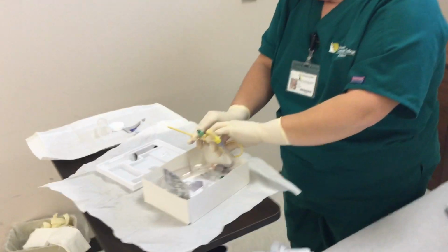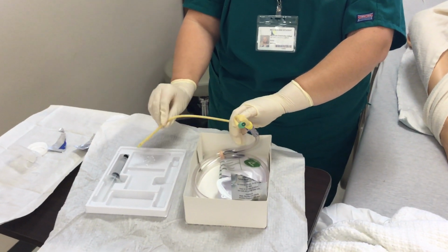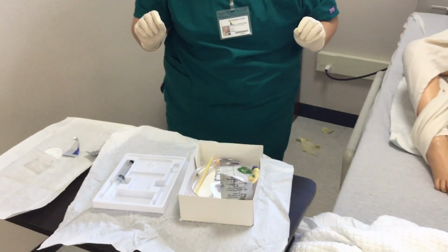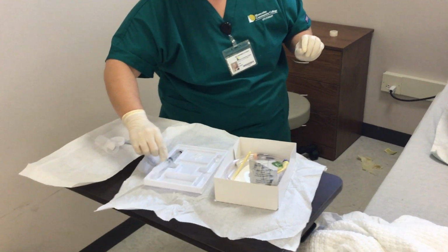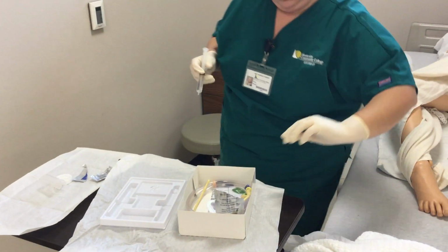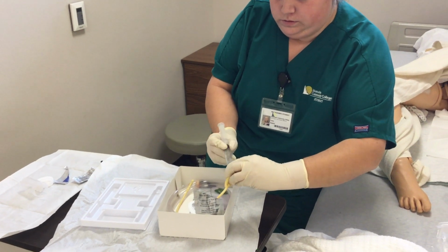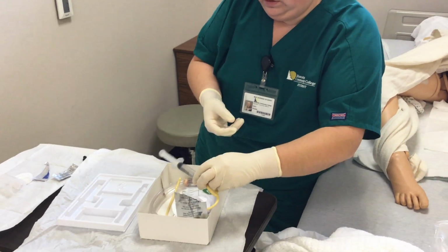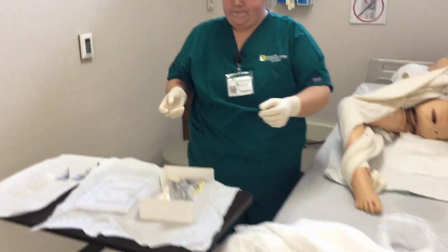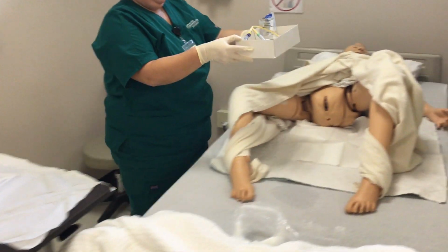Going to dip it in the gel. Then I'm going to come on here and get this out. So I'm going to put the shiny side down. And I want to always be keeping an eye on my catheter. Keeping my eye on my catheter at all times.